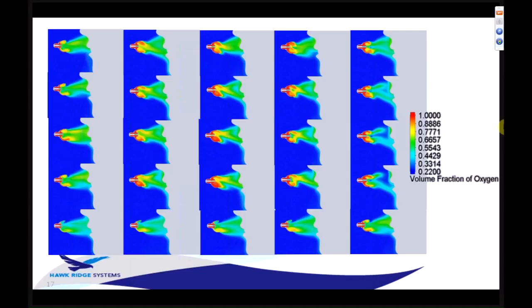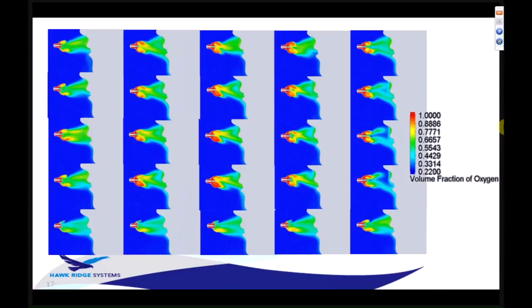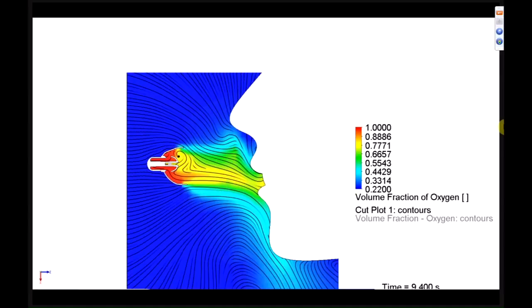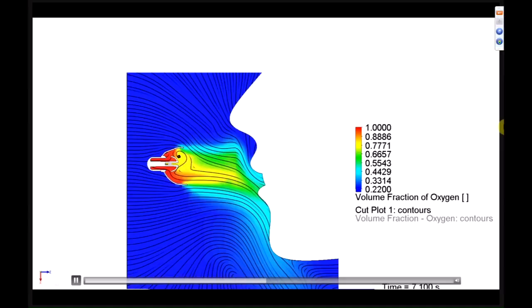Everything we've done here is a steady state analysis. We basically turn on the flow, see how the flow patterns develop, and look at kind of how it would stack up if it was like that for a period of time. The next thing we might want to do is look at a transient situation. This is sort of a breathing simulation they put together, where at different times in this video, there's fluid inhaled through the mouth, and then exhaled through the nose. And how does that affect the flow patterns and the oxygen concentration as we move through that cycle? So we're looking at more than just a steady state analysis. We're getting into what we call transient flow. And that's certainly possible in SOLIDWORKS Flow Simulation as well.